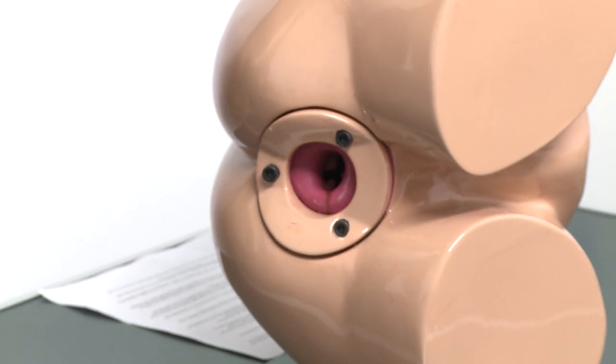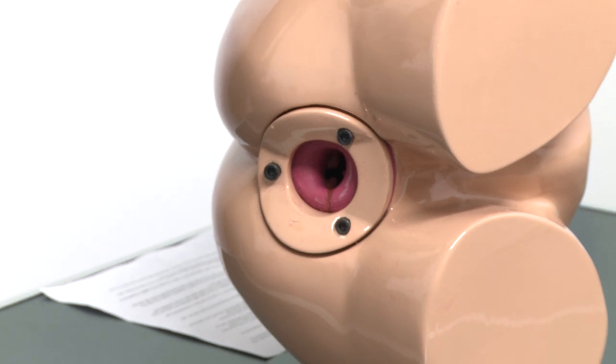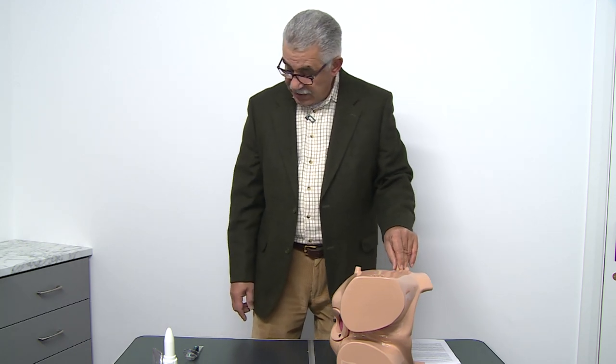For this procedure we are using a mannequin which we developed ourselves. It has a rectum and anal canal, and is designed for teaching rigid sigmoidoscopy and proctoscopy. It also contains hemorrhoids which we will be able to see.